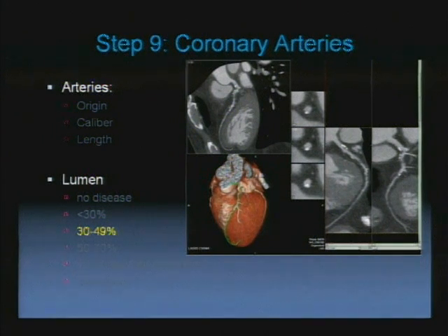If you do it the other way around, you're going to have some very bizarre findings, which even when you step back and look back retrospectively, you're not going to agree with. Okay? So look at it, make your own mind up first, and then use a measurement to validate it.